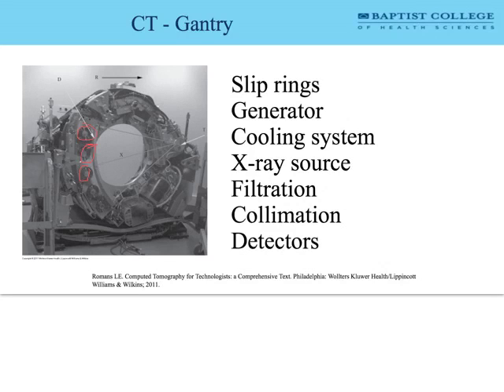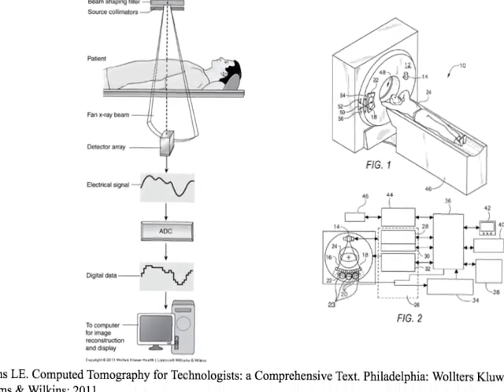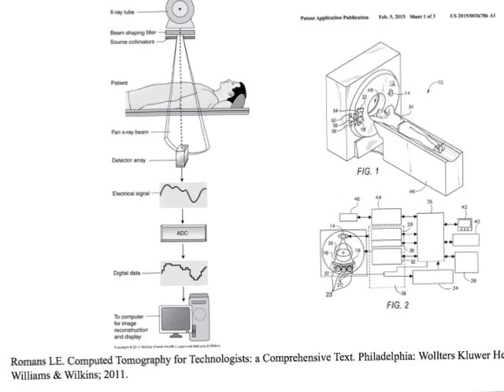Let's talk a little bit about, okay, so in here is an overview of the CT scan hardware. I'm going to zoom in on this so no one loses their lunch or anything. This is an illustration towards the end of our chapter in the textbook, on page 21. I really like this illustration because it walks us through every single aspect of data acquisition.